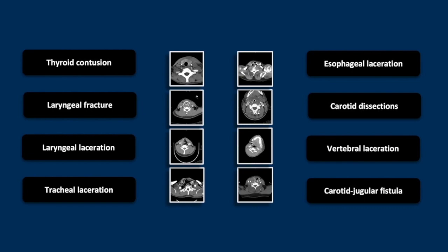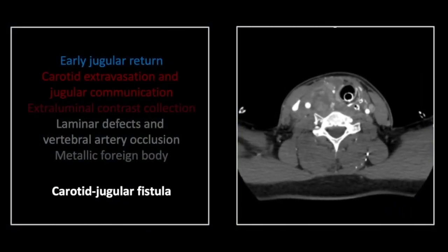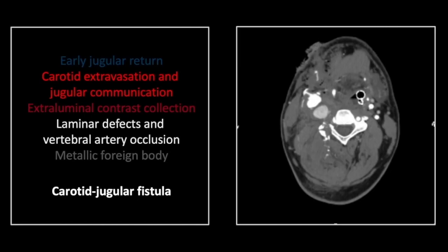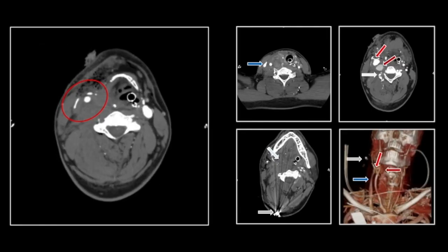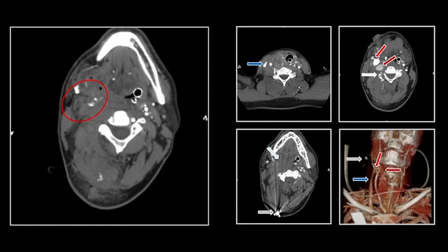Our last case is a carotid artery jugular venous fistula resulting from a gunshot wound. There is early jugular venous return. Compare that to the opposite side — it is a sure indicator that there is an arteriovenous fistula present. You can see that fistula where there is a communication between a carotid pseudoaneurysm and the adjacent jugular vein. There is an adjacent lobe making this actually a bilobed pseudoaneurysm. There is the communication between the carotid and the jugular.